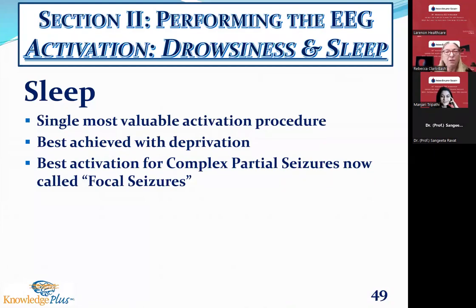With your patient, when they walk into the lab and they say, I just went, I say, go try again. If I had a nickel, if I had 5 cents for every patient that came to the end of their EEG and said, I could have slept, but I had to go to the bathroom, I would be a millionaire. I mean, it happens so often. Tell them to go to the bathroom.